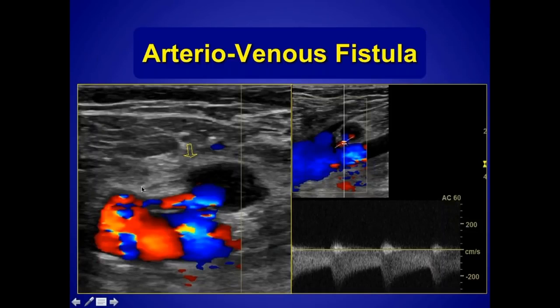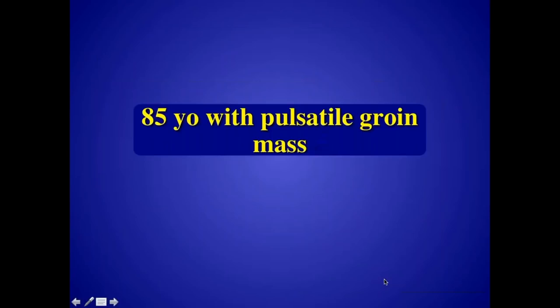And if, as we stretch it out, we can see, wait a minute, here's that neck feeding the cavity, but then there's a communication with the vein. So this is a complex fistula with a pseudoaneurysm component. The most important part to recognize here, you do not want to inject this with thrombin, because then the thrombin is going to thrombose the venous system. It's going to go right out of the pseudoaneurysm component right into the vein, causing thrombosis. And again, notice the classic fistula waveform.